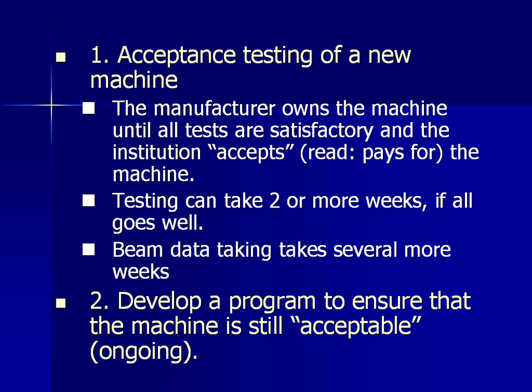So that other incident that I mentioned, they built it into a spreadsheet, and sometimes it's easy to have a cell in the Excel spreadsheet flipped, or off by a decimal place, or something like that. In that case, they did not do any redundant checks, and so they thought they had a certain output per minute, and it wasn't. It was 50% higher.